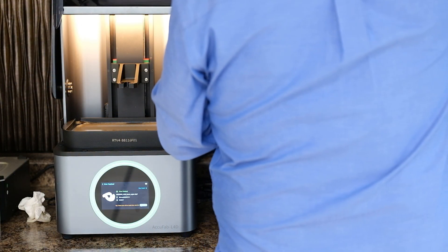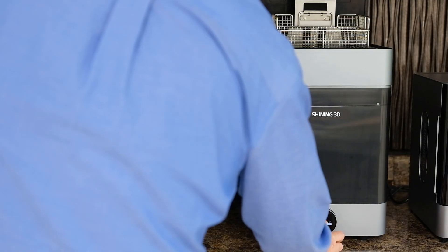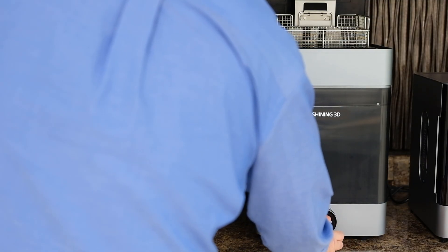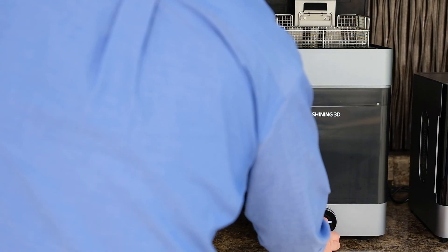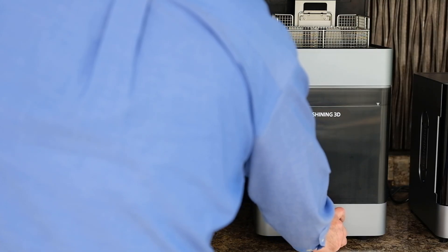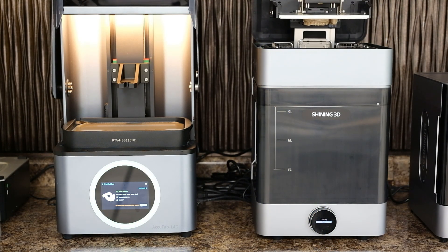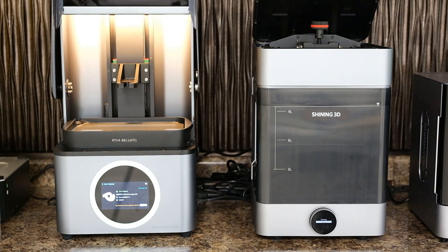Now you simply move your print base over to the fab wash. I'm selecting the correct resin I used — the OD01 — and then I'm going to click yes. I'm going to choose that I want it to wash and cut. It's going to automatically go down, cut the model off the base plate for me, and then go all the way down into the base once it cuts the base plate off, and then it'll go through a full wash cycle.